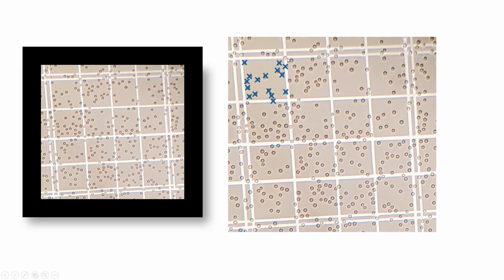Notice I didn't count this one up here because it fell on the top line, and I said I'm not counting that top line or this right line. But if a red blood cell falls on this left line, like this one right here or this one, I would count those.